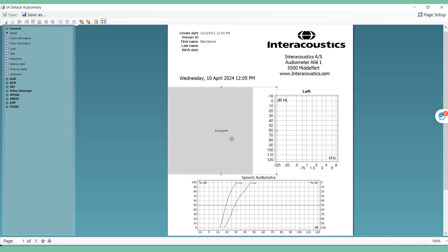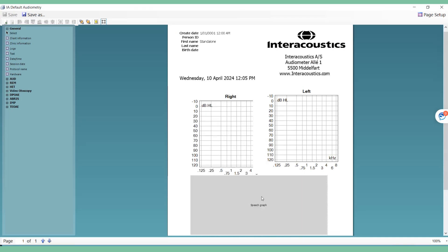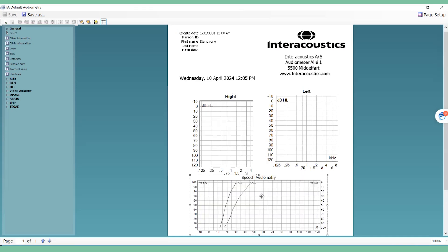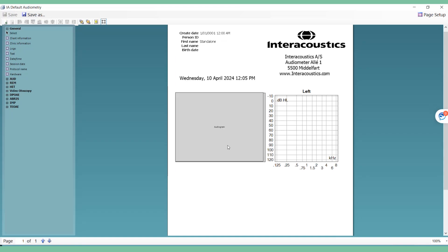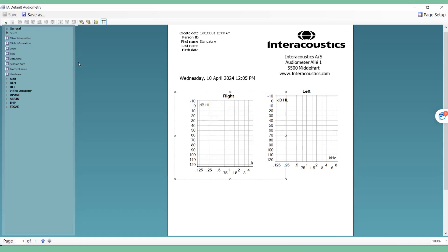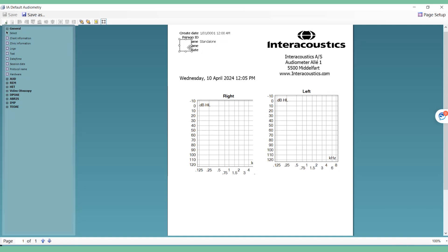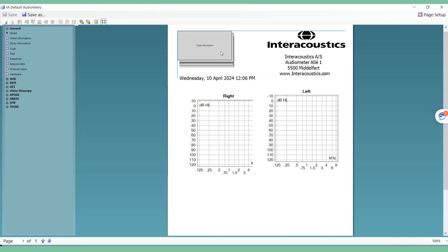You can now select items on the page to move, delete or modify. Hold and drag items from the left-hand menu which are relevant to your print design and drag them onto the page. Click to expand and move around the page.